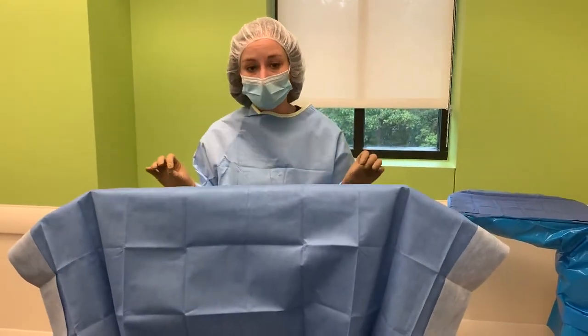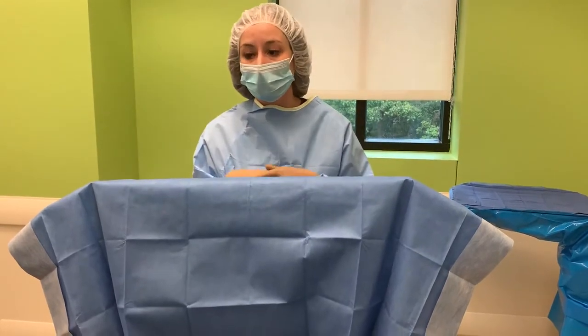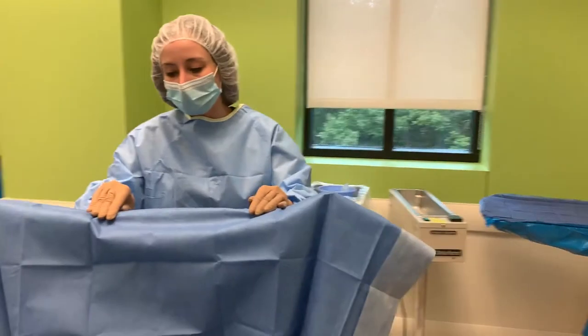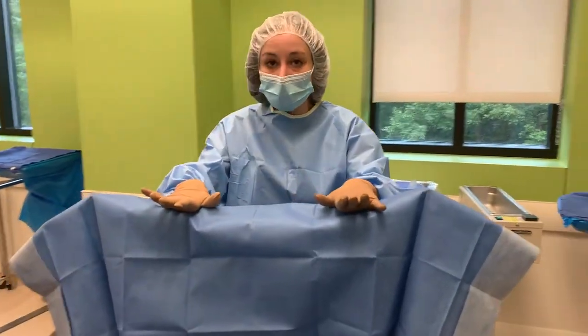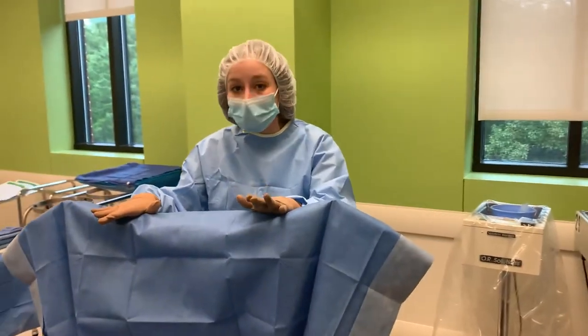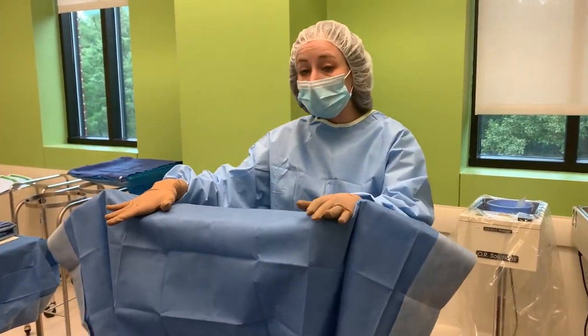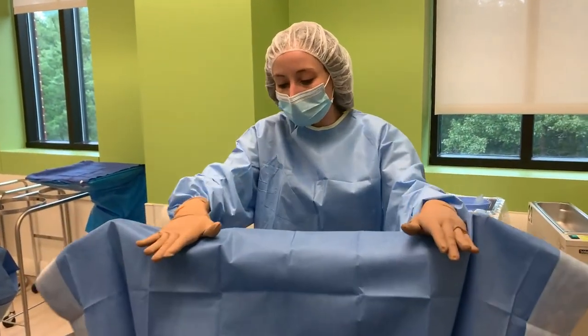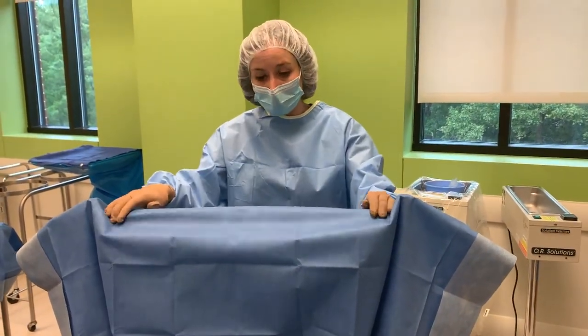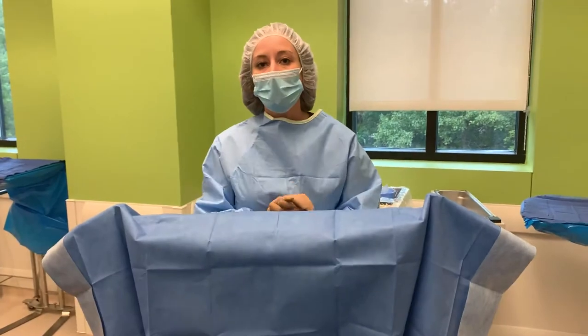Now we have a sterile lead screen, so when we hide behind it we can get closer, and this also helps us move it. Place your hand, push down, and it's on wheels so you can roll it where you need to. When the x-ray is being used, if you need to move it for you and the surgeon, you can do that now because you can touch the sterile drape. That is how you drape a lead screen.